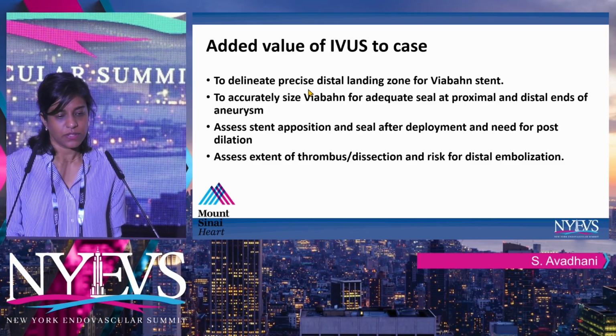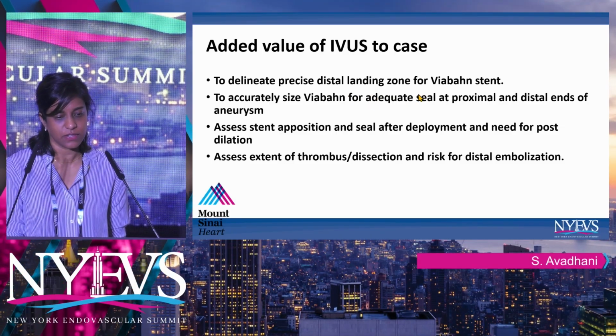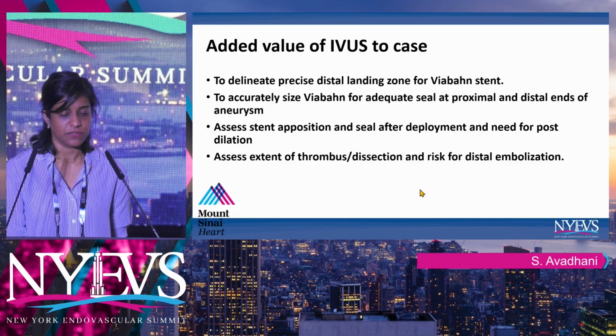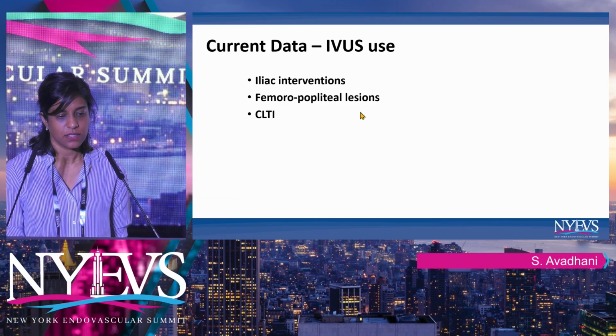So the use of IVUS in this case was not just useful for identifying our lesion and for our length of the stent and size, but also, like I said, it helped us with the decision about what kind of stent we were going to use in that case.